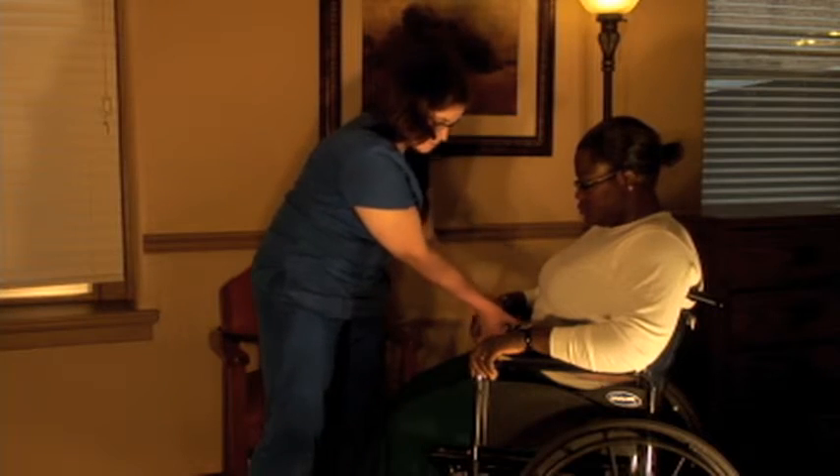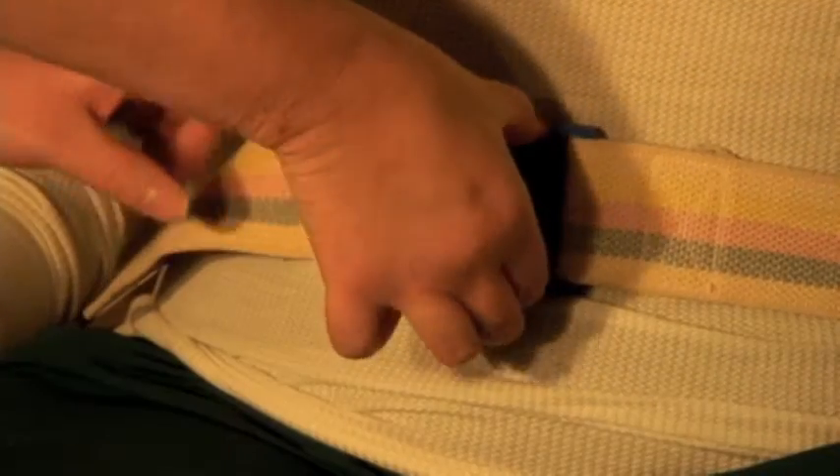Finally, help the resident to safely sit down on the transfer location. Ask the resident to slide back so there is not a danger of falling from the seated location. Once the resident is safely seated on the transfer location, remove the gate belt.